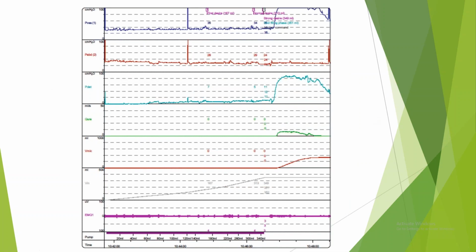Now this graph. Is this graph complete or incomplete? Complete. So now, is there any problem during the filling phase?